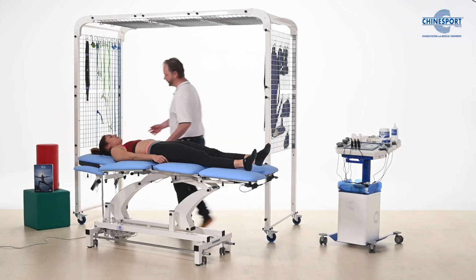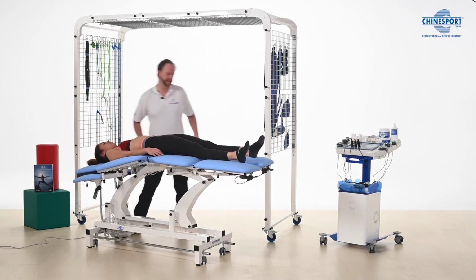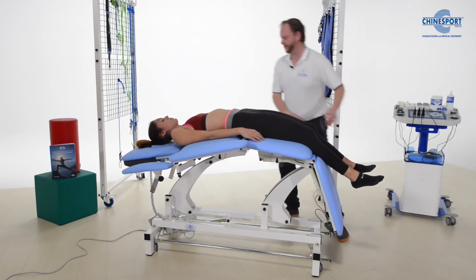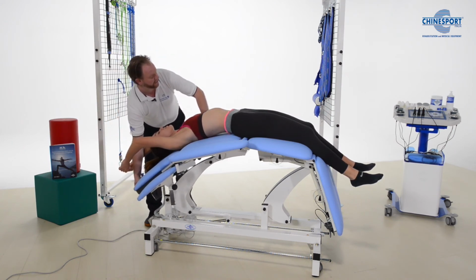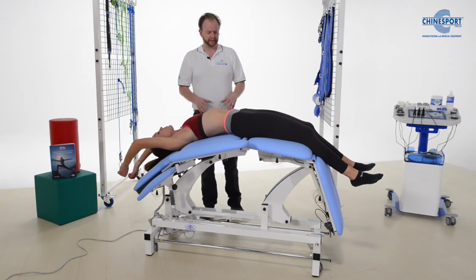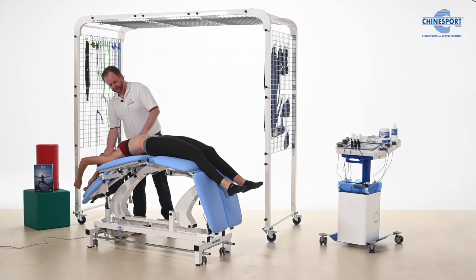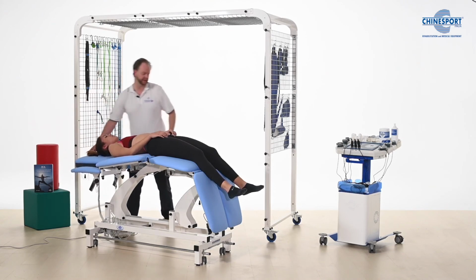Okay, and we can take our patient now as a final kind of exercise. We can go completely into extension just so you can see the extreme positions that we can achieve with the table. You can lift up again, and we always check the breathing, check that there's enough abdominal breathing. For somebody who has back pain, often the sensation is very strange. People think that they are in this massive kind of yoga bridge pose, but as you can see, it's not, so it's very safe. You can come back. But we're letting gravity do the work, and we can target specific muscles.